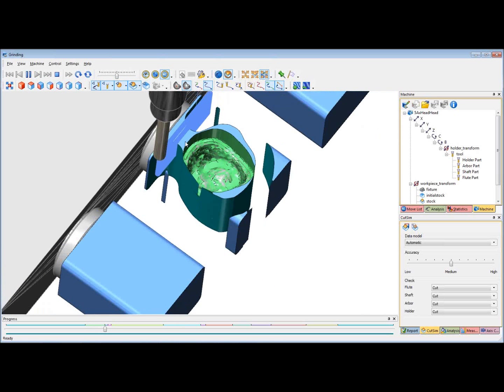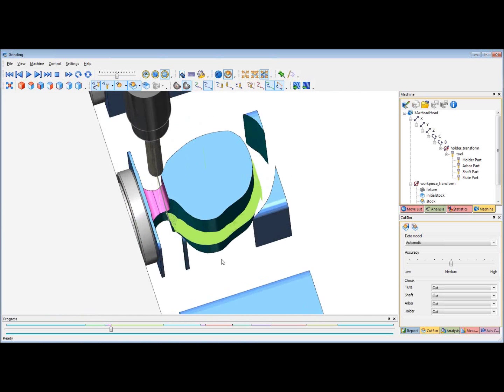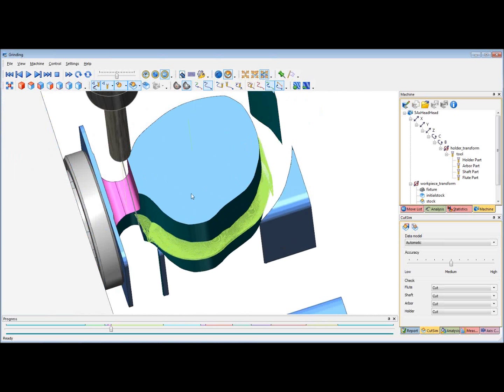Then we have a roughing operation for the material that's left over the pins from both directions. The next toolpath is a spiral constant cusp toolpath from outside to in. That would rough and finish the occlusal side. Let's simulate this toolpath here.